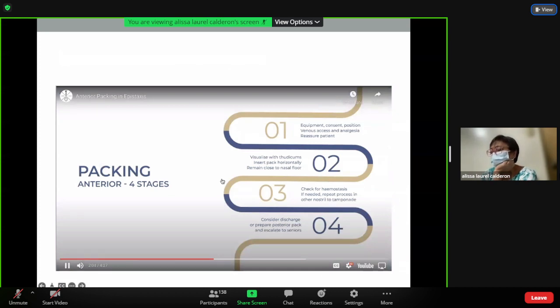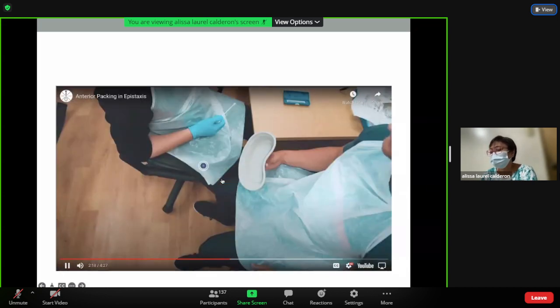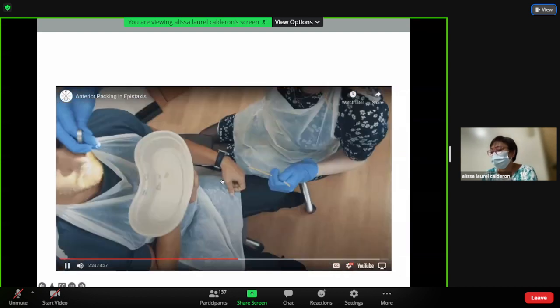Stages for anterior packing, shown here for later reference. Anesthetize the patient if needed. Use a good light source and explain the procedure to the patient. Give them a kidney dish and position them correctly. They should be sat upright in a chair and you should be sat close. The positions for both right-handed and left-handed doctors are shown.